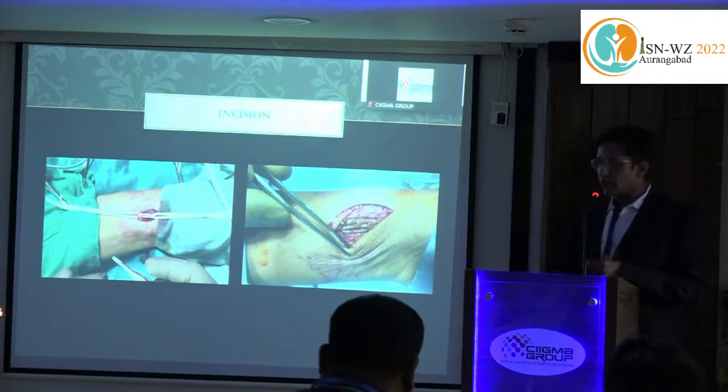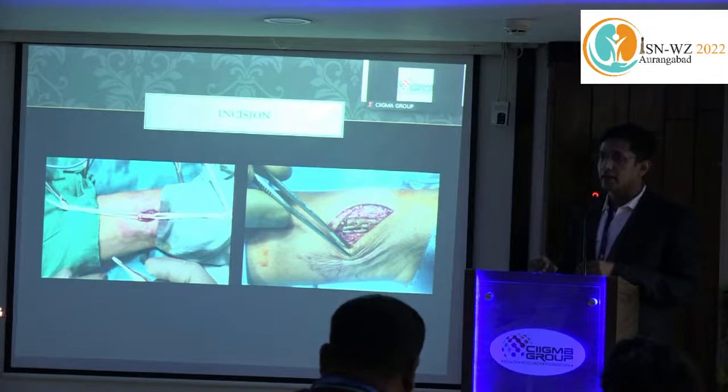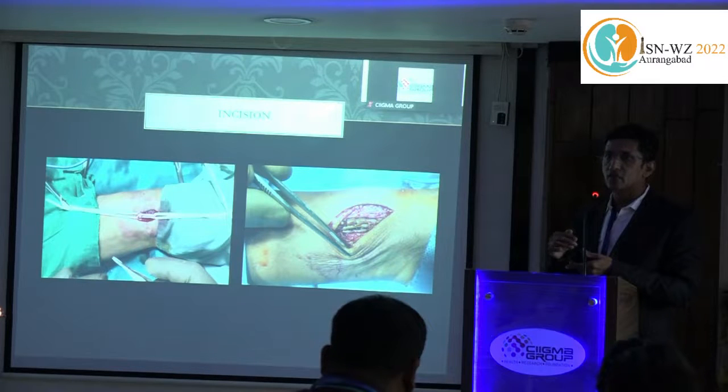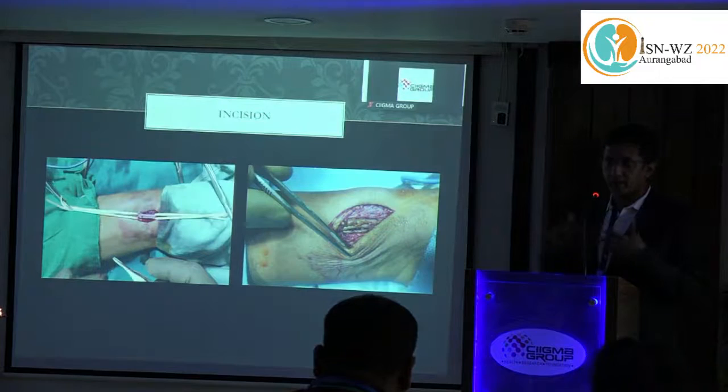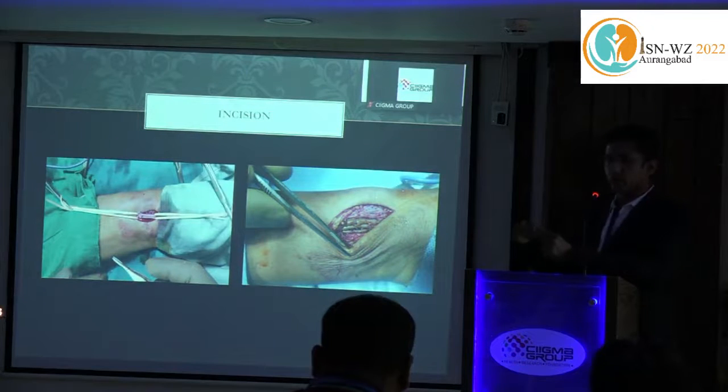So where to give that incision? If the distance is high, always try to give the incision towards the arterial side. If the vessels are in close proximity, you can go in between. I prefer that if the distance is like 2 mm, I will go exactly between the vein and artery.